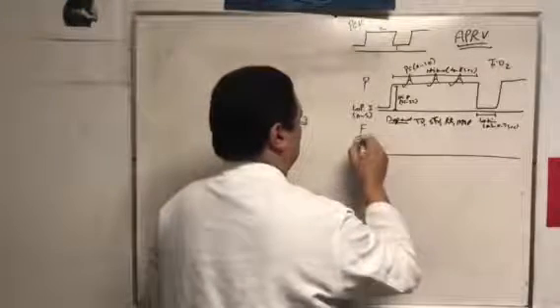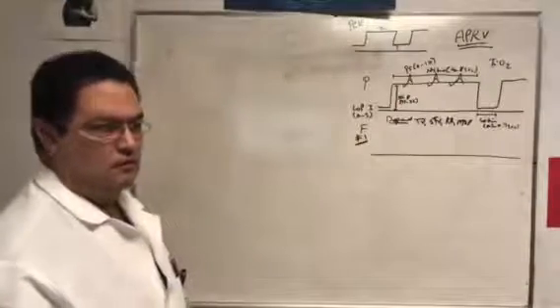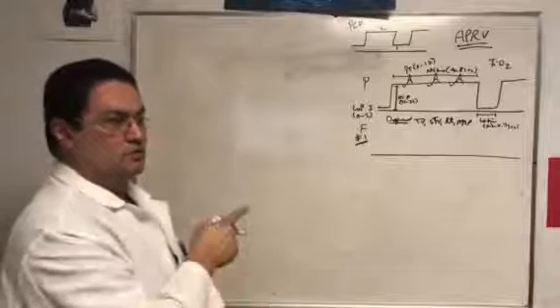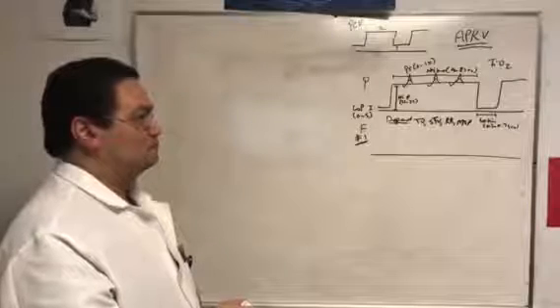The flow waveform is the most important thing that you need to learn about classic APRV. So if you decided to forget everything about this, don't forget this one, because that's how you're gonna kill patients, right?